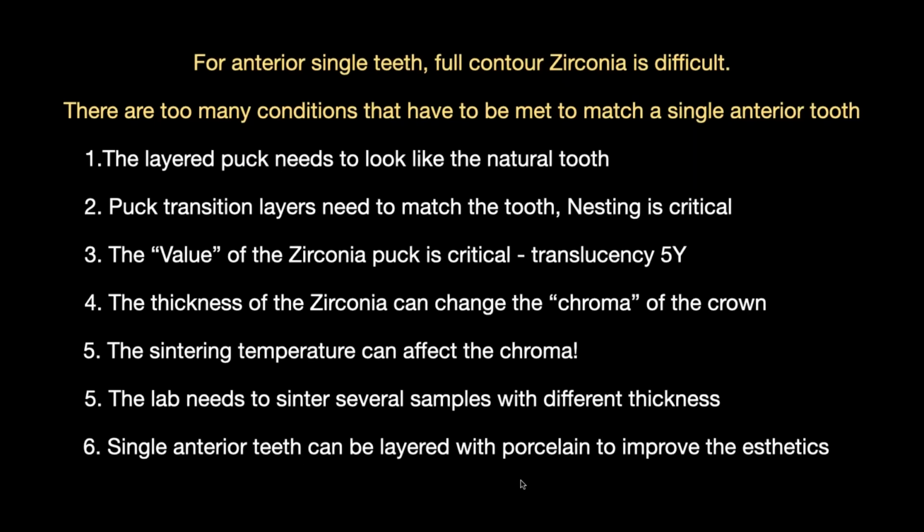Now let's get into the zirconia. For single teeth, full contour zirconia is really difficult, and there's too many conditions that have to be met in order to match a single tooth. Honestly, ask yourself, do you know what the zirconia you're using is supposed to look like? I don't. They don't send a crown inside every box of a puck and say, look, when you fire it, this thing needs to look like this.